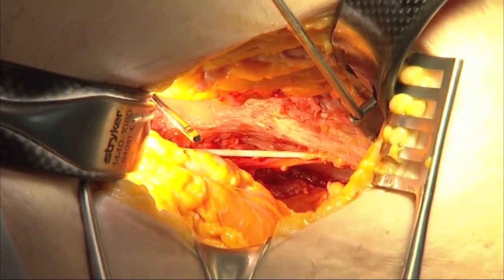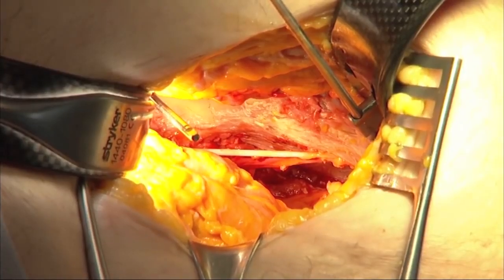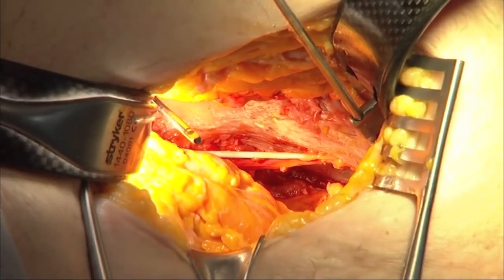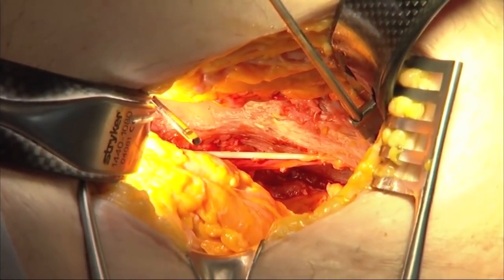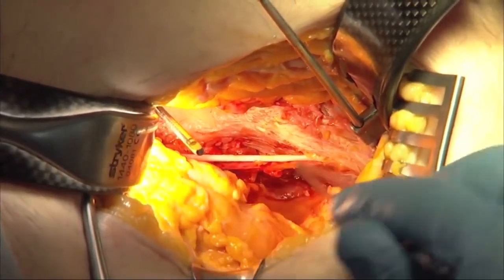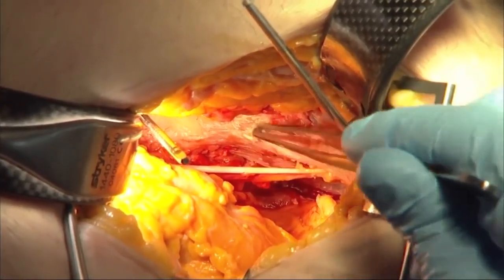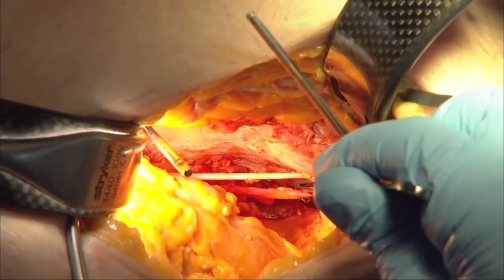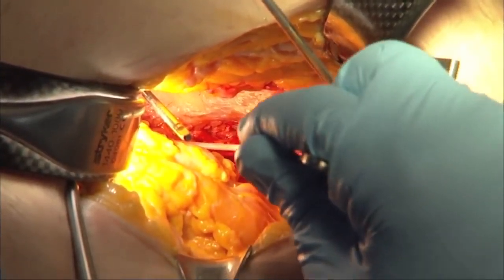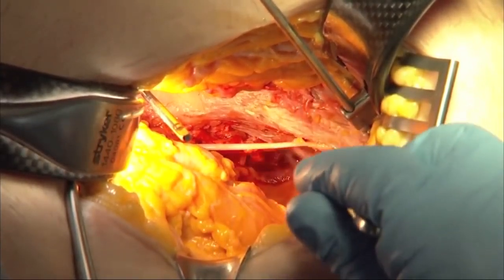This is really advantageous for us because what we used to have to do is wear a headlamp. Now we can take the headlamp off and you can see how well these light pipes illuminate the wound. Now what we're going to do, and I'm hoping that you can see down into the depths of this wound, is expose the obturator neurovascular bundle, which is right here. The white structure is the obturator nerve, and directly underneath that is the obturator vein. We need to mobilize safely these structures so that we can expose the quadrilateral surface, which is right here, and that's the medial wall of the acetabulum.